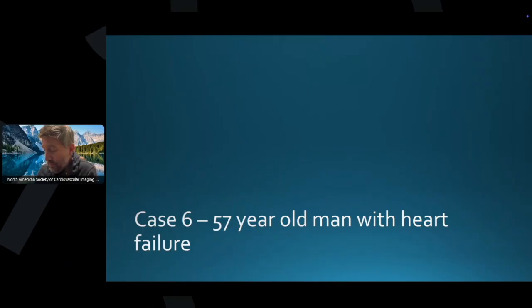I'm curious how the device will be latching enough because of the surrounding friable tissue from the infarction. I'm curious to see one. That's what I was going to say too, where I was fooled one time on this because they wanted the measurements on the CT, but I didn't caveat. I was like, just so you know, there could be a thin amount of fibrosis here that I'm not seeing. Then they get the MR and the actual VSD was small, and there's a band of very thin fibrous tissue. So I was going to ask, how do you guys measure the defect?